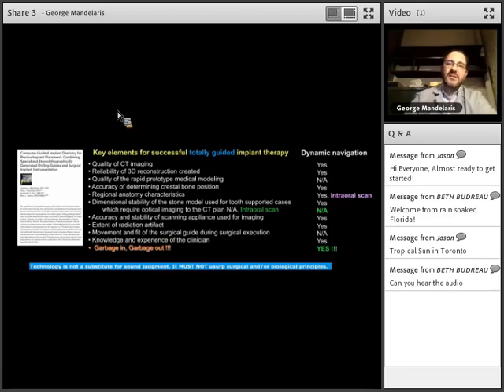As I mentioned in the last 2 sessions, the team that they've assembled at Navident is really spectacular, and they're really there to help you be successful, me included. So anytime there's been problems with my cases, and there's certainly been some, they're always there to help and make sure that I'm successful. And what I've found is that most of the time I'm the problem, and you just have to reach out to get the solution.